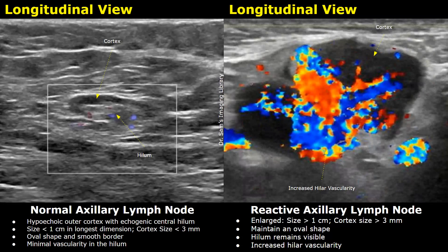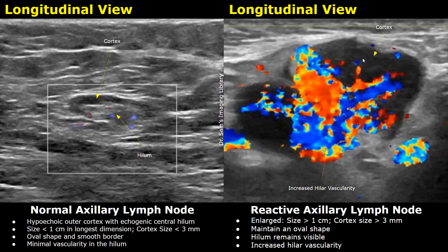This is another image showing hypervascularity in the central hilum of a reactive lymph node. The lymph node is enlarged and the cortical thickness is also more than three millimeters.